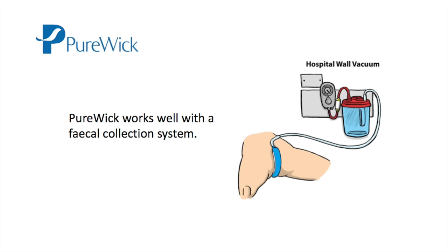If patients are having frequent bowel movements, then you can use a fecal collection system with Purewick.